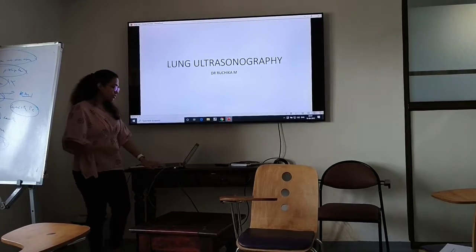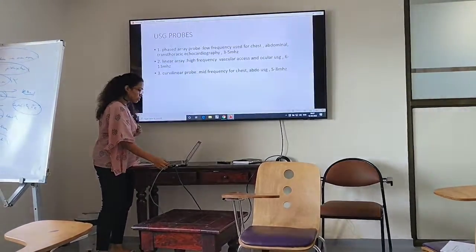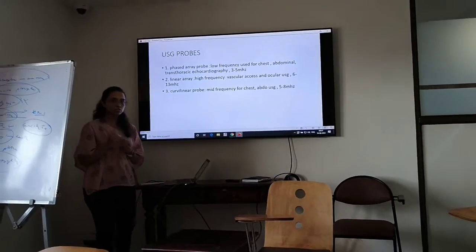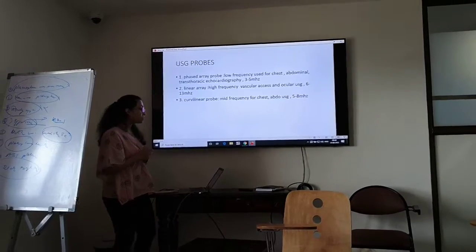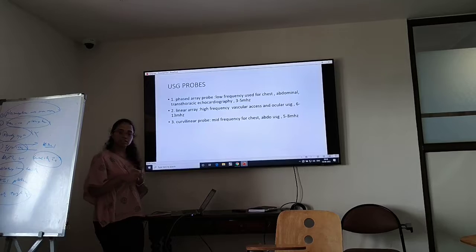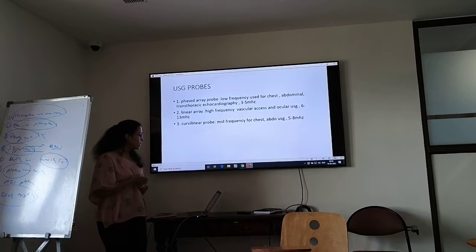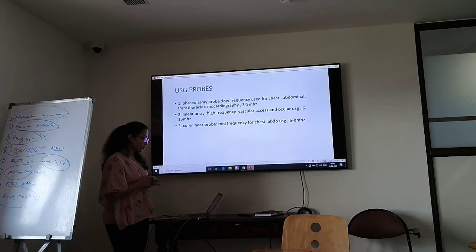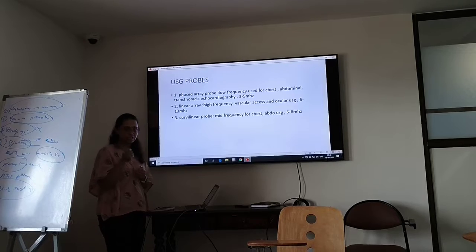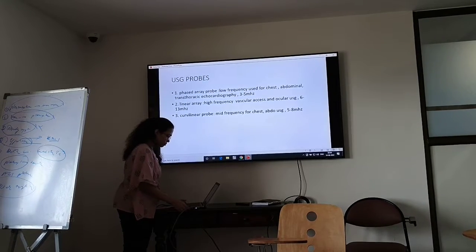Good morning everyone. Today's topic is lung ultrasonography. When we do USG of the lungs, there are 3 probes that we use: the phased array probe, the linear array probe, and the curvilinear probe. The phased array is low frequency, used for chest, abdominal and transthoracic echocardiography, usually between 3 to 5 megahertz. Linear array is the high frequency vascular probe, and curvilinear is the mid frequency probe for chest and abdominal USG.